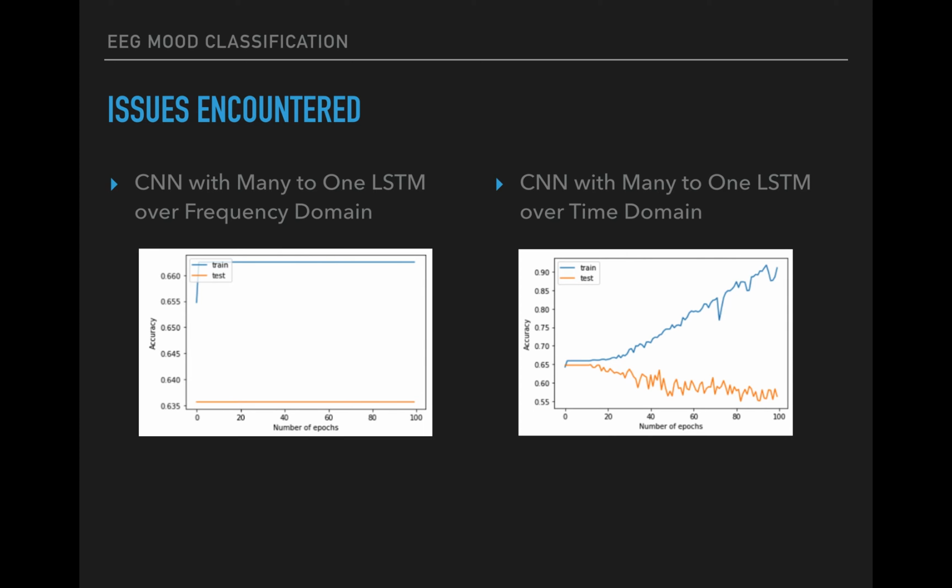Though we were getting better training results from the raw EEG data, we determined that our models were now overfitting. To address this issue, we tried adding dropout layers and regularizers to the model, but when added, our models fell back to the same accuracies as when we processed the FFT data.